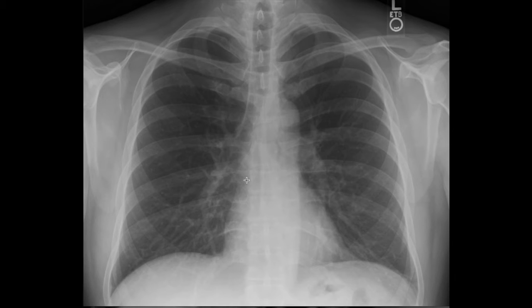Unlike the AP view, where the anterior aspect of the body receives the X-rays and they come out from the posterior aspect, you will have distortion in the size of the heart. The heart will be enlarged, and when reporting such a case, you can report that the patient has a cardiomegaly when it's not true. So this is something to take care of.